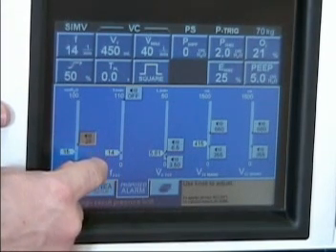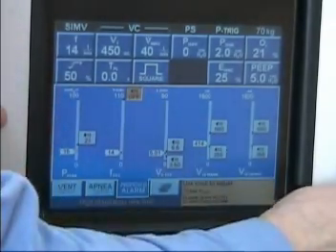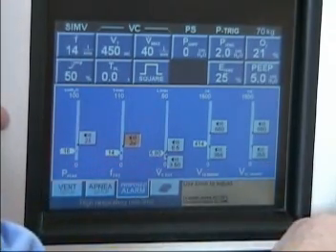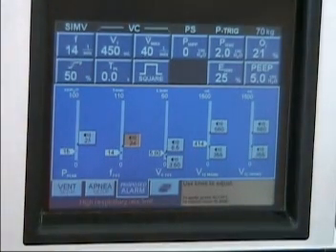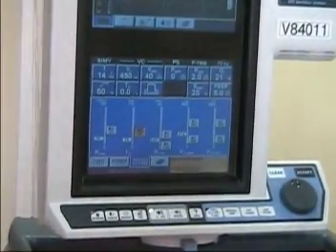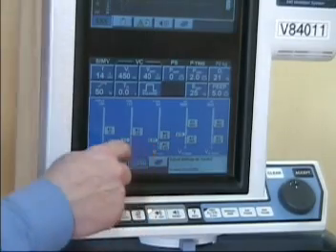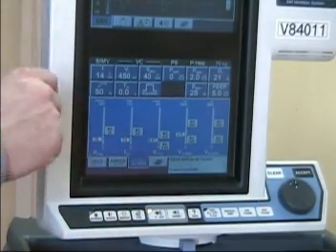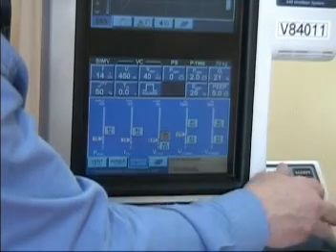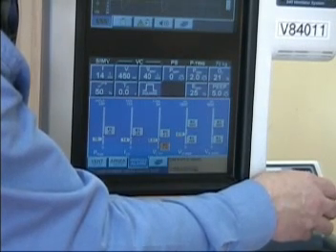Our next is frequency total. If the patient was breathing more than just the ventilator, you would see this number higher. Typically we set the frequency at 10 over what the patient's breathing. It's at 14, so we'll set it at 24. We have to press the accept button. Then we have V.E. Total — that's minute ventilation — and it's reading 5.8. We want that 2 to 4 above, so we'll set the high at about 8.5.